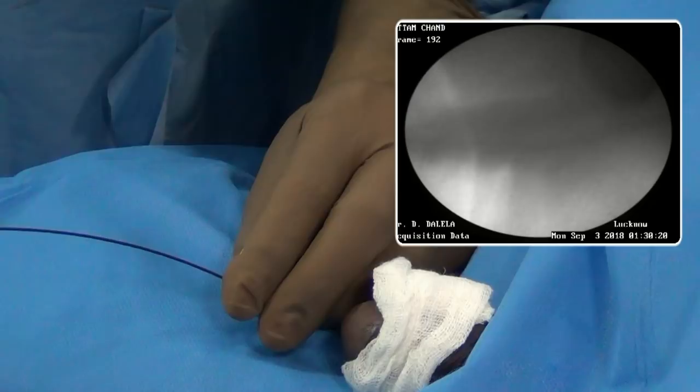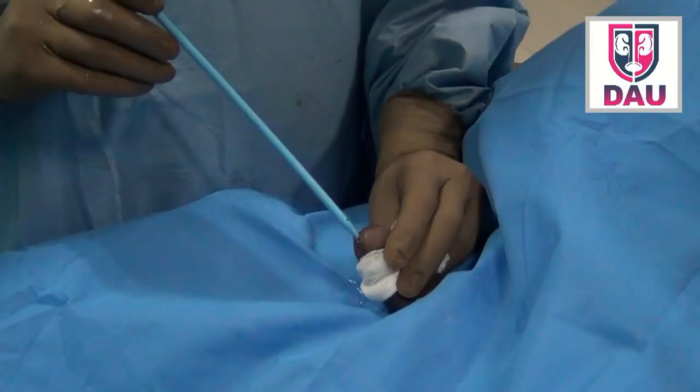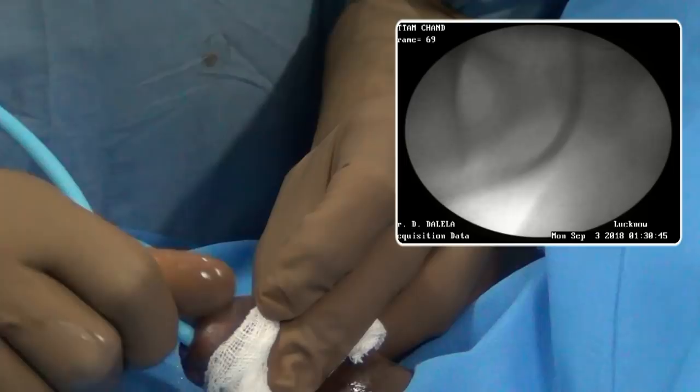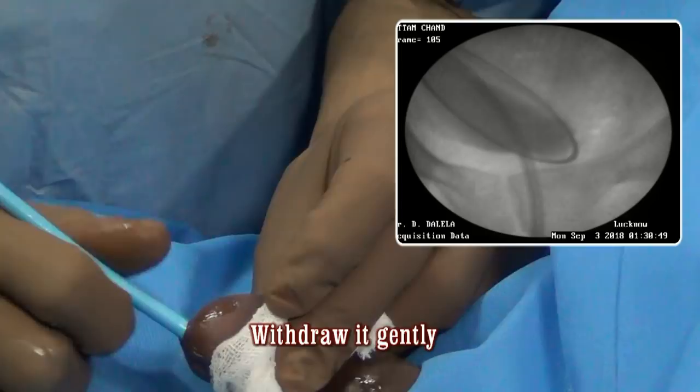Having dilated the stricture, withdraw this dilator. Now it is time to pass the next dilator of increasing caliber, again following it over the guide wire. As you insert this dilator into the bladder, do not over-insert it because the tip can hurt the bladder wall — at that stage you need fluoroscopic vision. This dilator is then also removed.